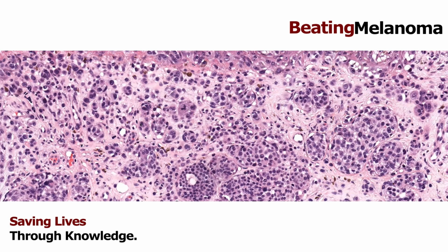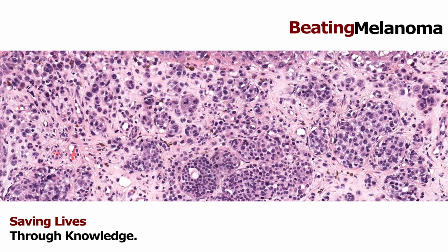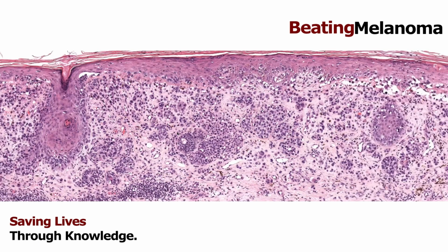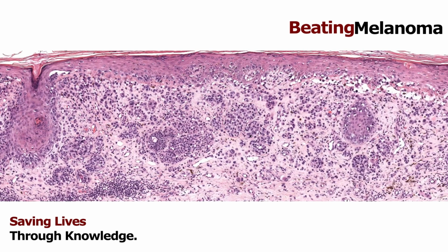Let me interrupt you for a second, just for the interest of time. We have a few minutes left, because one thing is there's a very important component called the Breslow thickness. Can you tell us, it's from the top of the skin to measuring the deepest melanoma cells. How do you measure that?